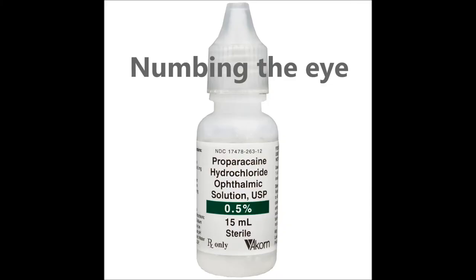Before measurement, we need to numb the patient's cornea, as it contains the highest concentration of nerve endings anywhere in the body. This is why getting something in your eye can be so irritating.